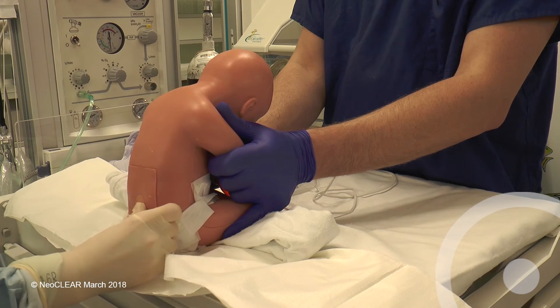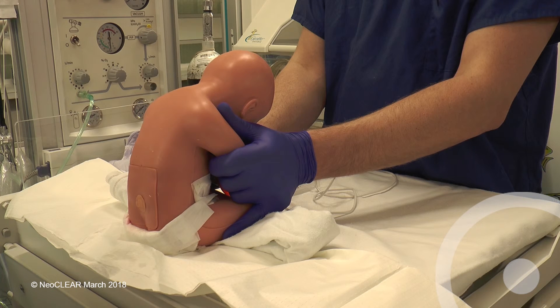Ensure no CSF or blood is leaking and apply a spot plaster or spray on dressing. After disposing of sharps and clinical waste, complete the case report form and update the parents.